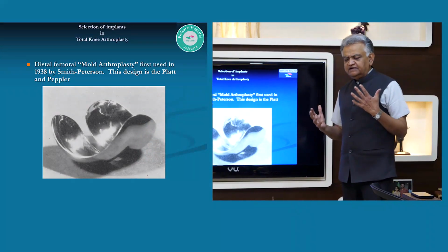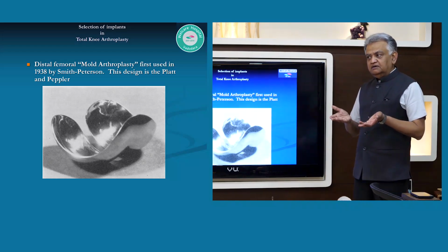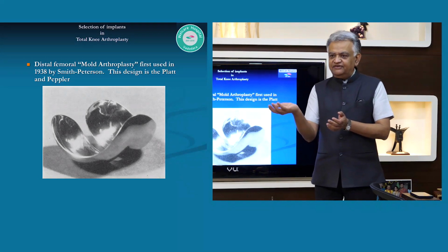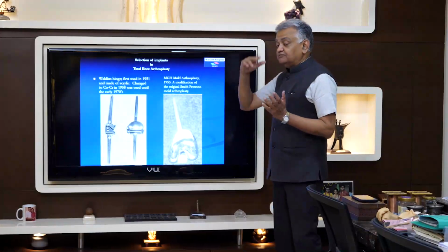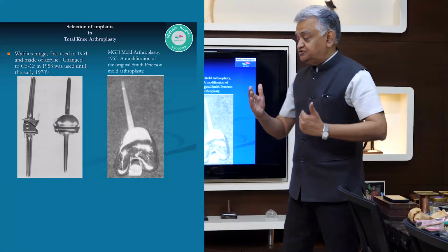Next, please. And then from there, we jump straight to the 20th century, in the early mid part of the 20th century, where relatively modern engineering sciences started creeping into medical sciences. And Smith Peterson came up with a simple concept of mold, just resurfacing the lower end of the femur. Next. And then from there, we ended up doing an actual implant, which means connecting the two sides together.